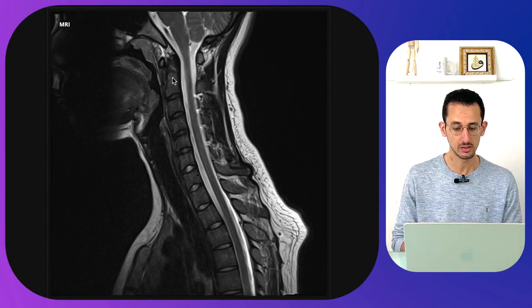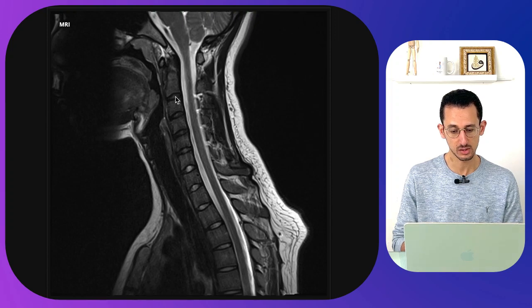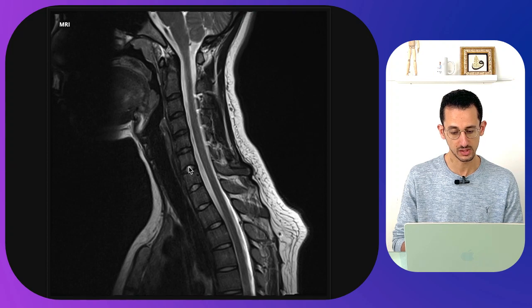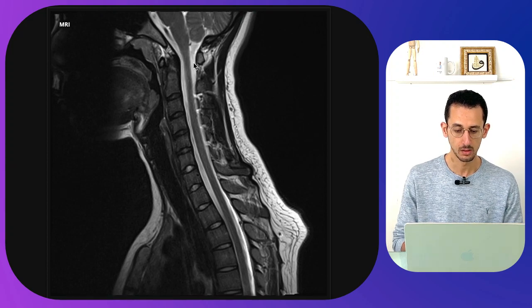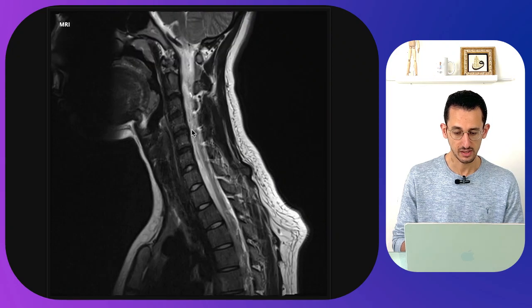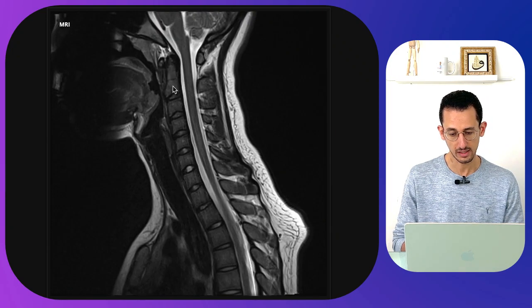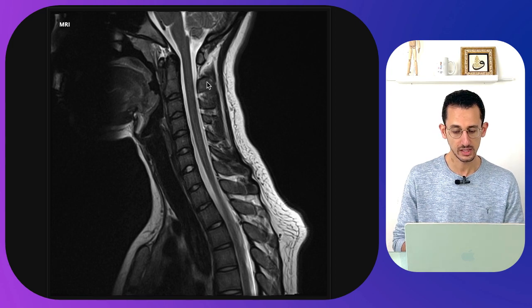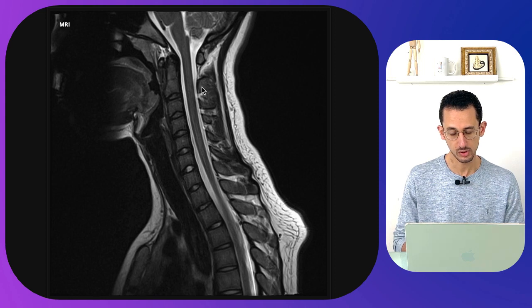In between the vertebrae you will find the intervertebral discs: C2-3 disc, C3-4, C4-5, C5-6, C6-7 and so on. The white signal is the CSF which goes around the spinal cord. Posteriorly you can see the spinous processes of C2, C3, C4, C5 and so on.